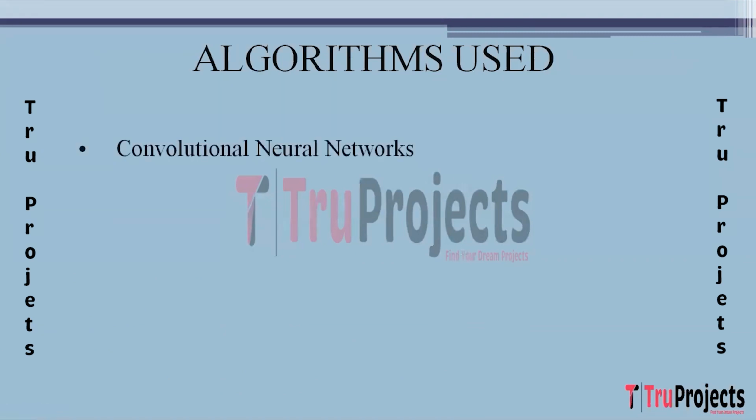So the first algorithm built is convolutional neural network. So CNNs are designed for processing grid-like data like images by automatically learning hierarchical features through convolutional layers. These layers apply filters to detect local patterns, preserving spatial relationships within the ECG images. In ECG signal analysis, CNNs excel at extracting essential patterns from the spatial representation, making them robust for identifying complex arrhythmia-related features.